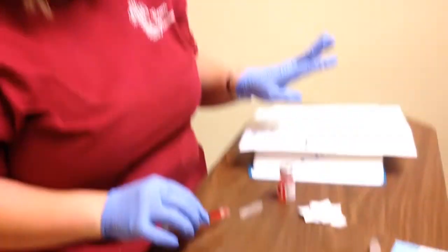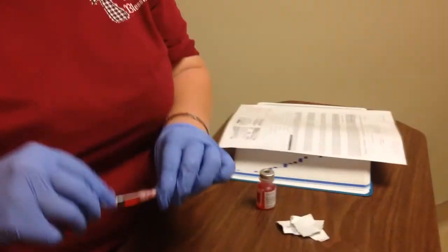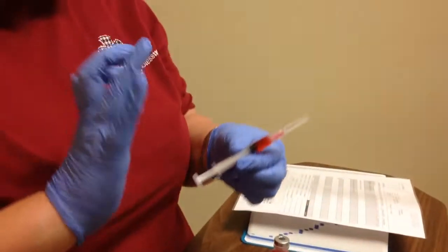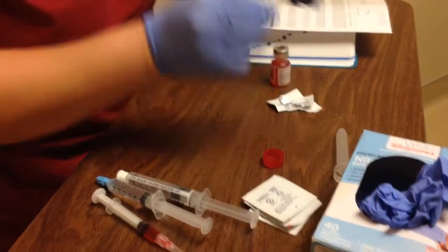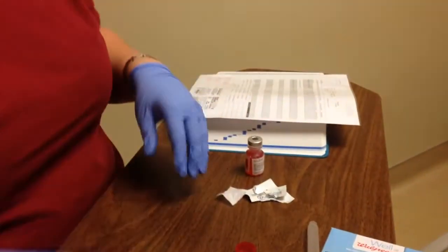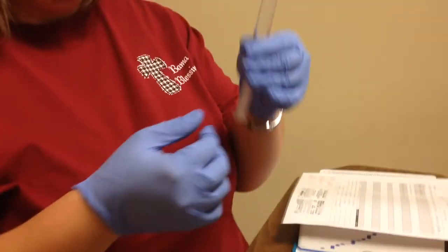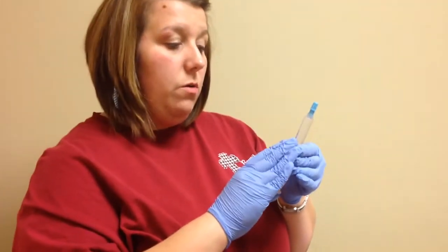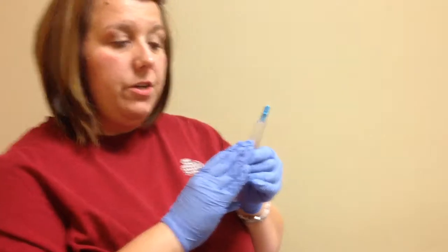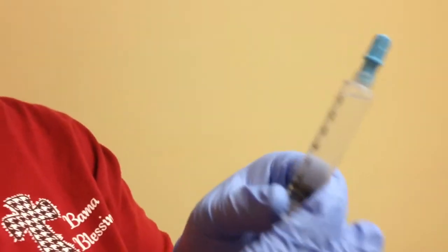So to keep it safe, I want to make sure I scoop. Okay. Go ahead and we're fixing to dilute. So just keep in mind that most of your facilities will have saline injections that are in a syringe. So the way to dilute this, remember our drug book said we needed to dilute with 5 milliliters of saline. So what we're going to do is get our excess saline out.